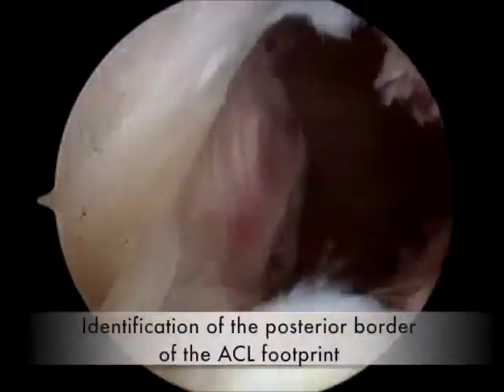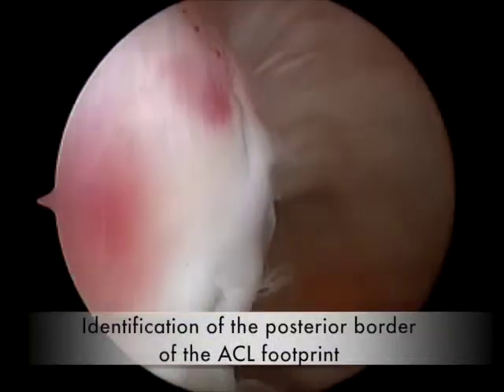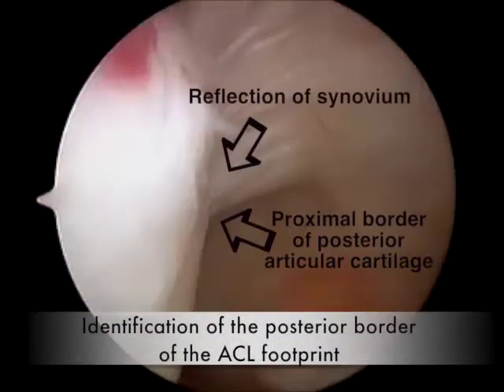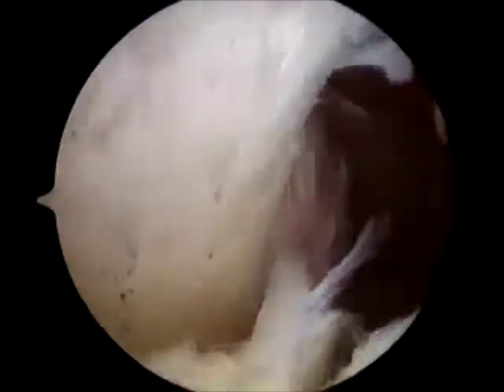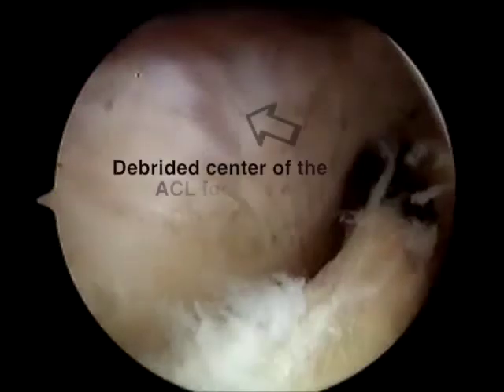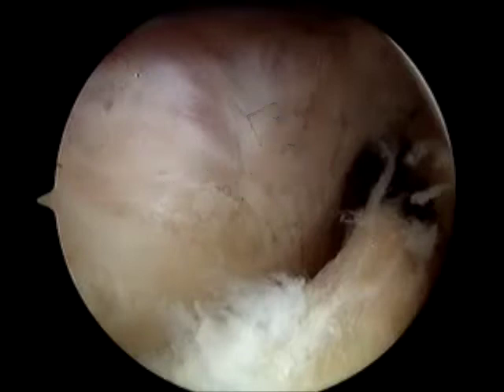Here we're looking through the anteromedial portal into the back spaces of the knee. We see the reflection of the synovium and the end of the articular cartilage where they converge. As we retract the scope distally, and that is straight distally along the line of the femur, we pass right above the center of the ACL footprint.